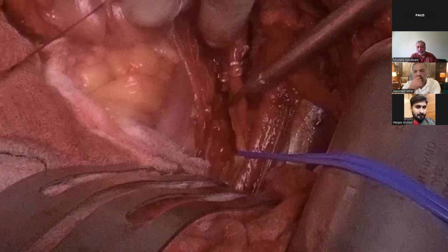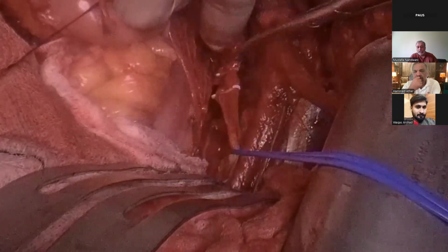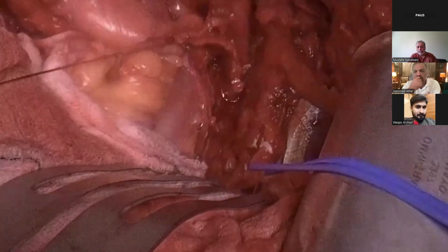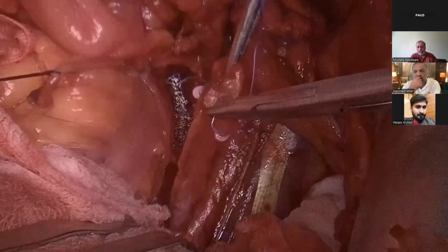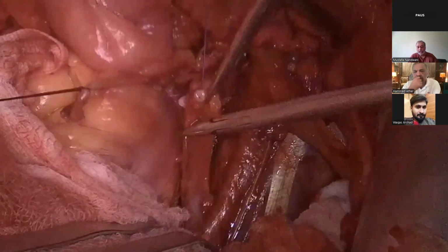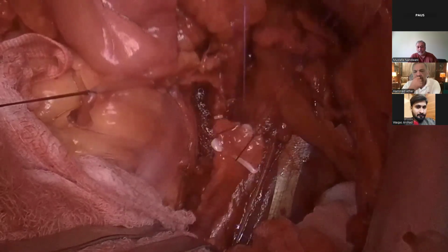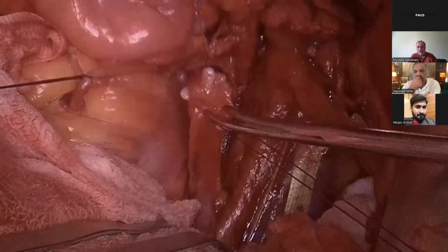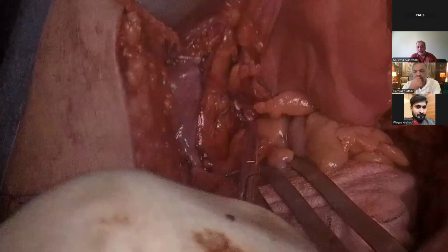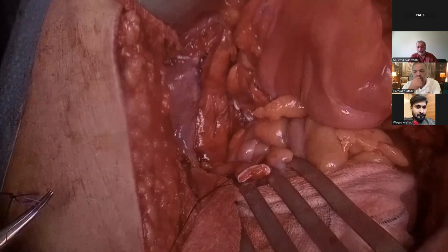And these are the ureters, which I send for the frozen section. So in this way, double clips towards the distal end. And then there's one distal suture, that's for the identification of the proximal or distal end. And then there's a stay suture. So you see that once this is cut, the suture will stay in a distal position. So the ureter is cut, the stay suture is there.